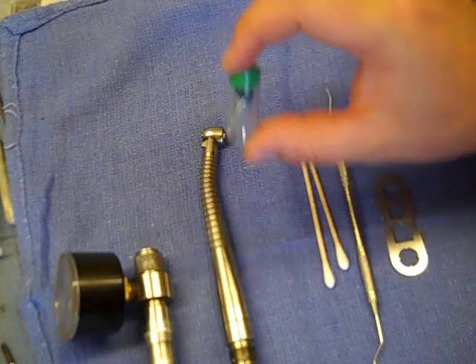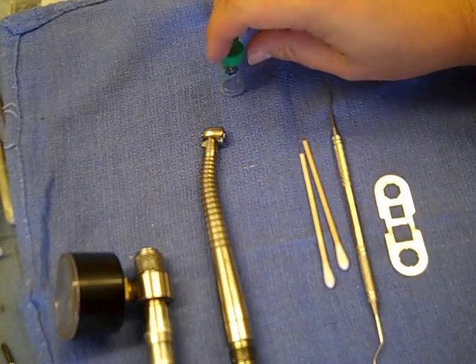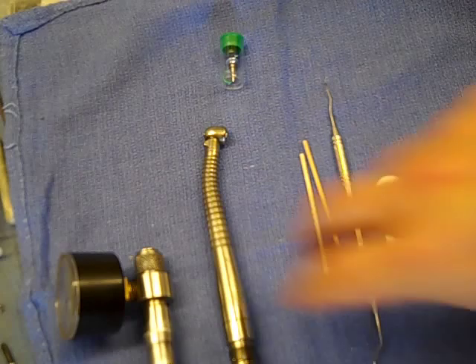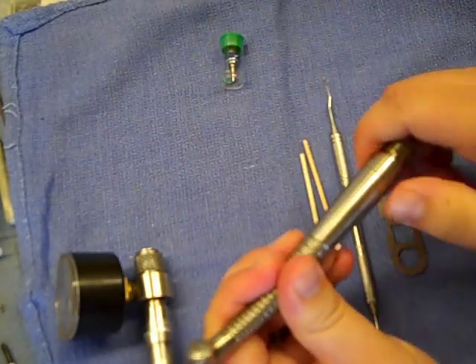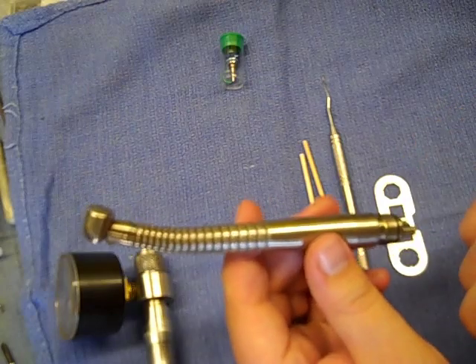I'm going to show you how to install a new turbine from Maxdine Handpiece Turbines. The company name is Diversified Dental and we manufacture the Maxdine Turbines. This is for a Midwest Tradition L power lever — same basic principle for the XGT or the push button model of the Tradition.